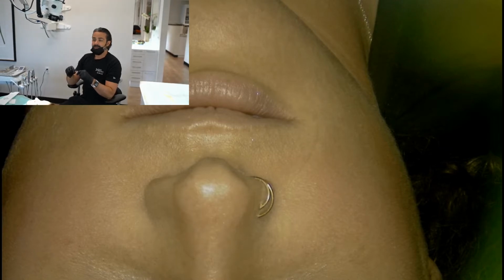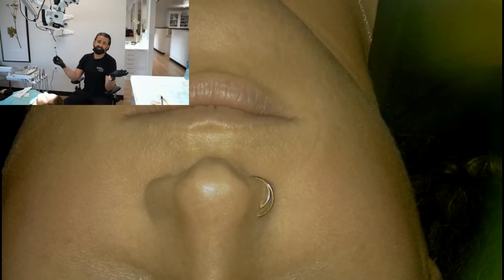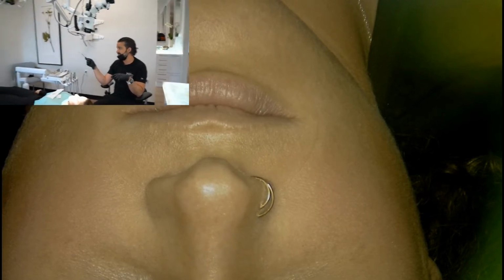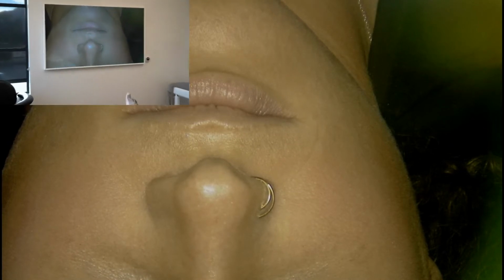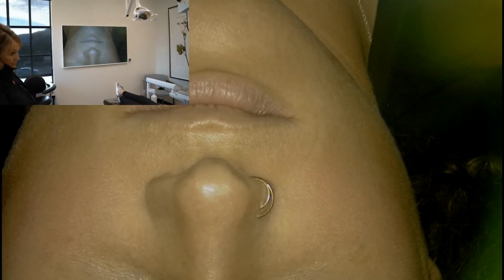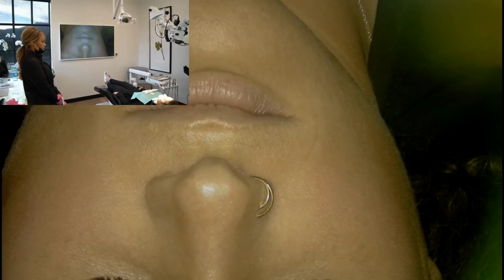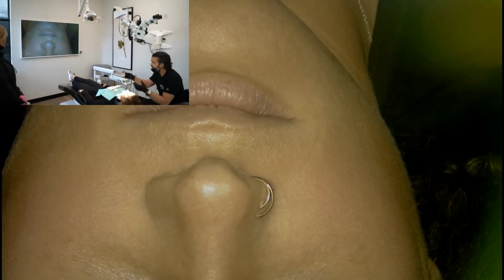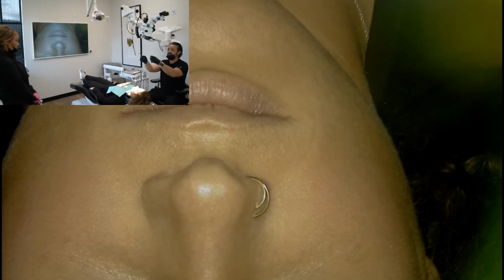Thank you. So I think in general dentistry, that's not a bad statement. As an endodontist, no. Most people aren't wanting to look at a big TV screen like you want to show them this in the room. This is really because I teach procedures out of this operatory, and so that's the reason for that big screen, and people are standing behind me outside, over my shoulder outside the room. And so that's something that I do, and I put it right at the foot. And obviously you have to have a room designed to allow for that. It's a very comfortable space when you're working like this. If I was not in 12 o'clock, then I would put it over on this wall.